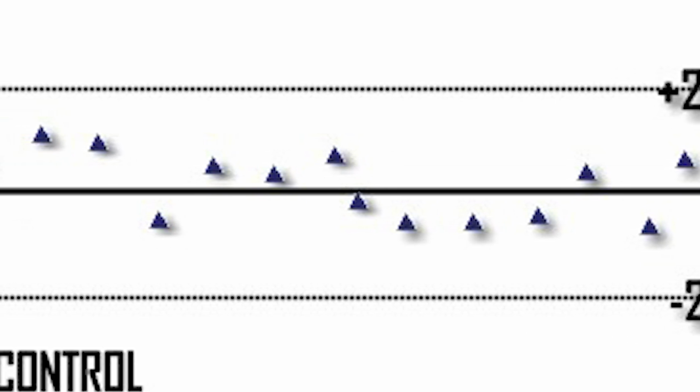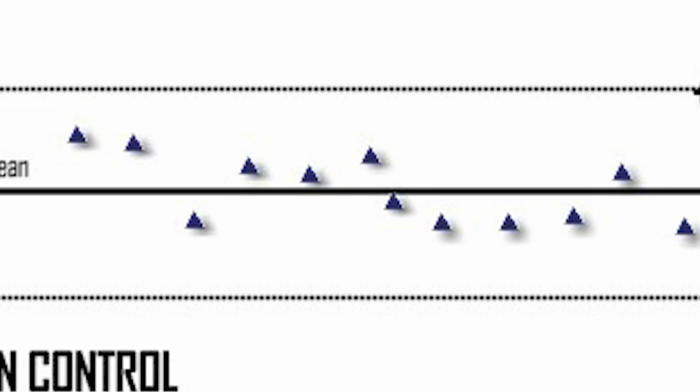We can then take that information and we can plot it on a graph. And if we look at the points on that graph, we can tell some things, and we need to watch that graph very carefully to see what it looks like. Now, these graphs are commonly called control charts. That's kind of a generic name, but they may also be called Levy-Jennings chart, and here's one right here.